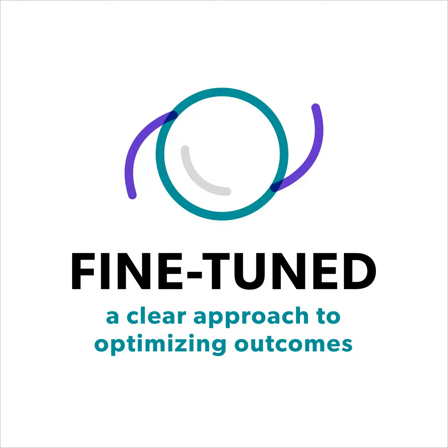So let's dive into the particulars of wavefront-guided and wavefront-optimized laser refractive treatments. Can you explain the difference between the two? Sure. Wavefront-guided technology uses a non-contact laser that projects a pattern into the eye. The laser passes through all of the ocular tissues, including the front and back surface of the cornea and the lens, and then is reflected back off the retina. The image is then captured on a charge-coupled device. The distortion of the projected pattern is then analyzed using Fourier reconstruction to design a treatment pattern for the laser ablation.